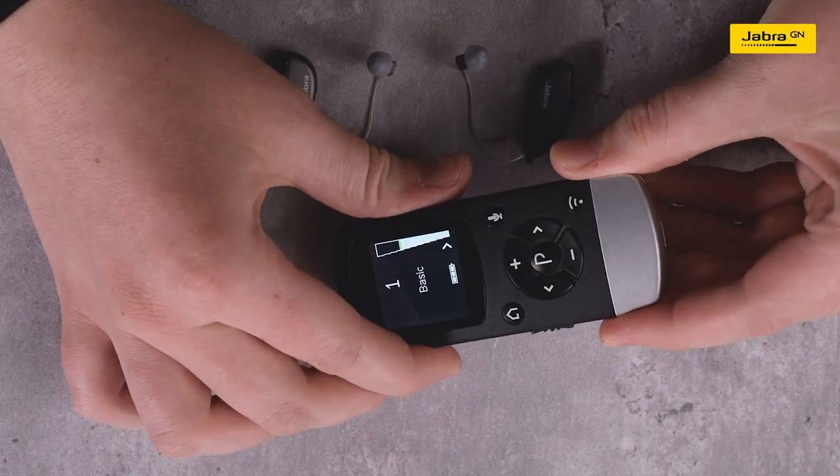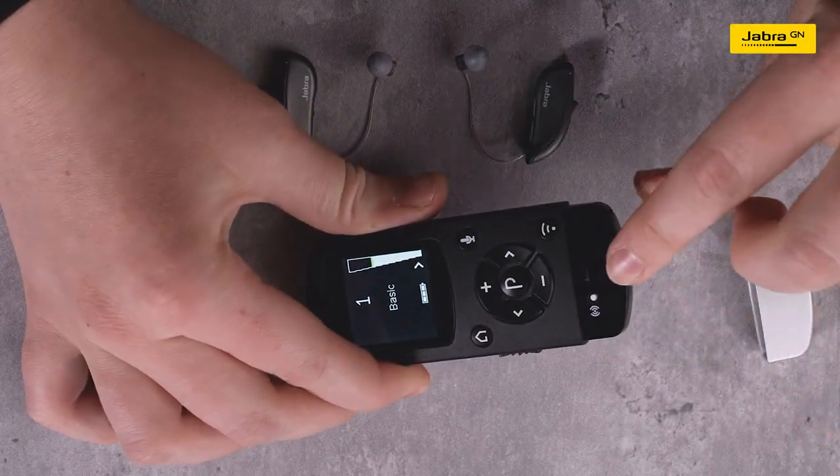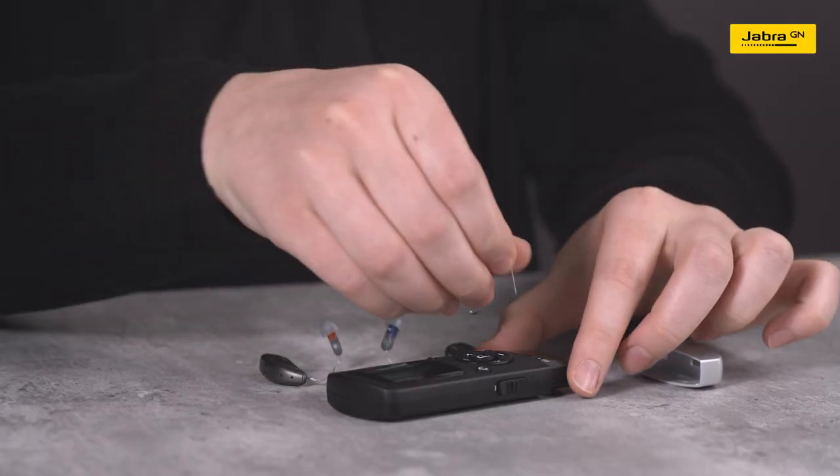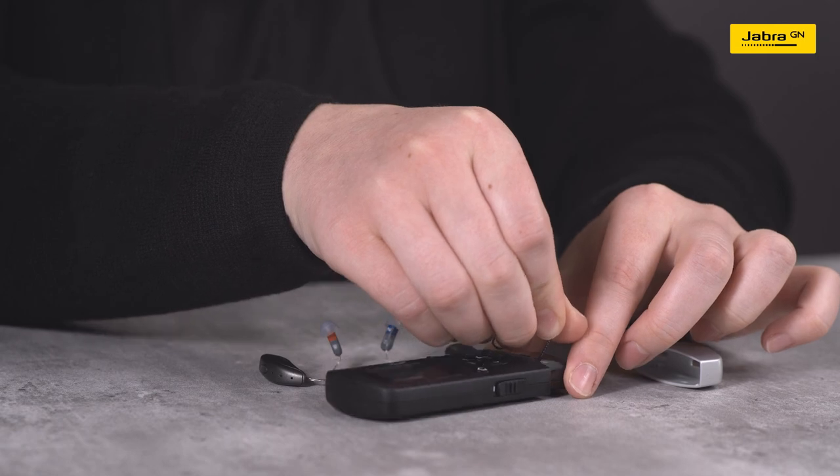Remove the silver cap on the bottom of the Remote Control 2. Locate the small white pairing button. Push the pairing button once to activate the pairing process.